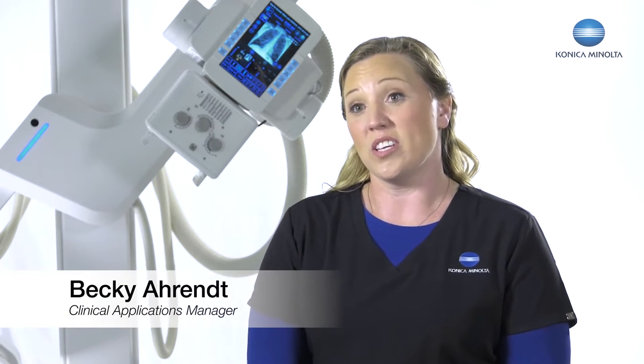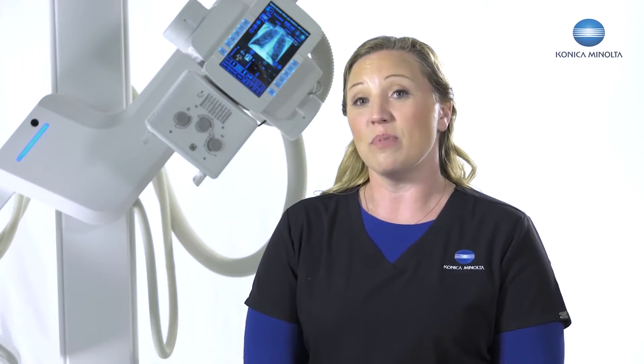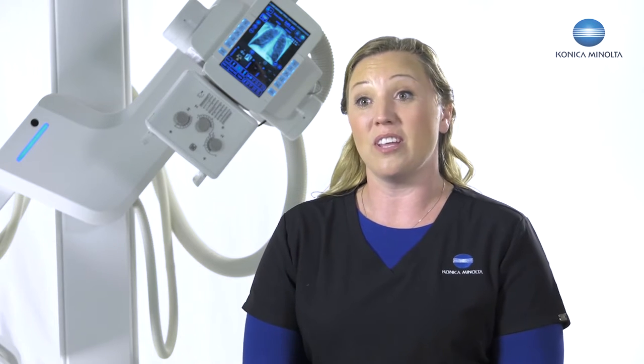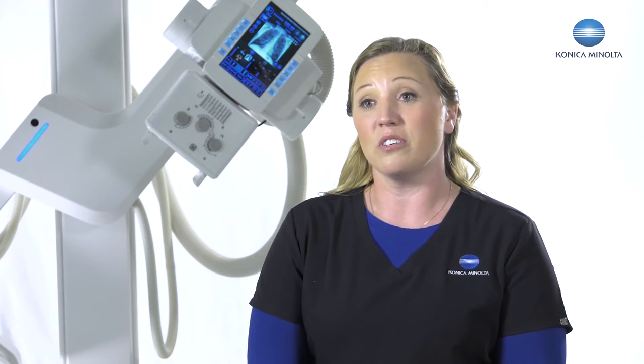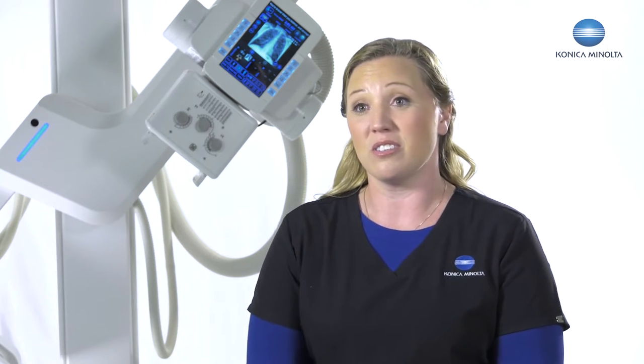I've been doing applications for 15 years and I've been a technologist for 20 years. I'm excited about the third generation U-Arm, as there are so many clinical and patient benefits to this machine. We can now do a weight-bearing AP foot and move it straight to a lateral without getting my patient off the stand. That's a huge clinical advantage for both the technologist and the patient.